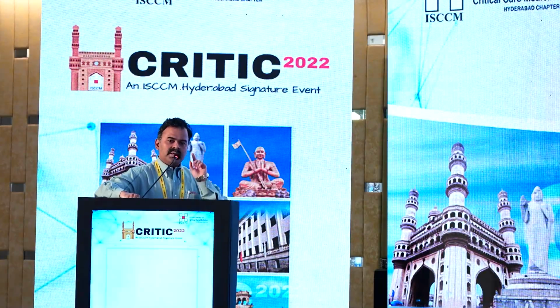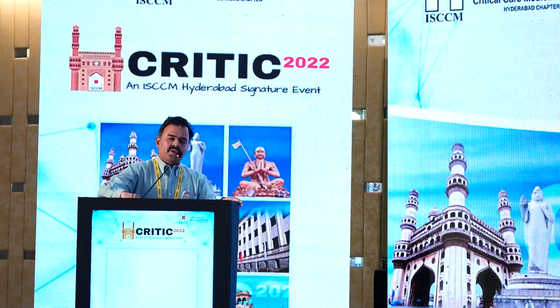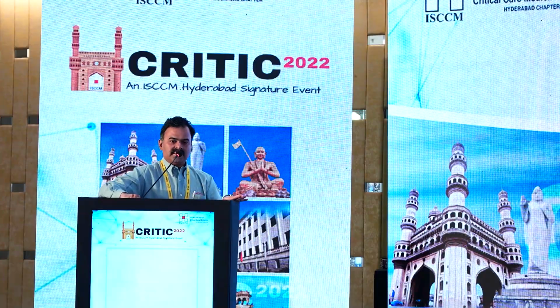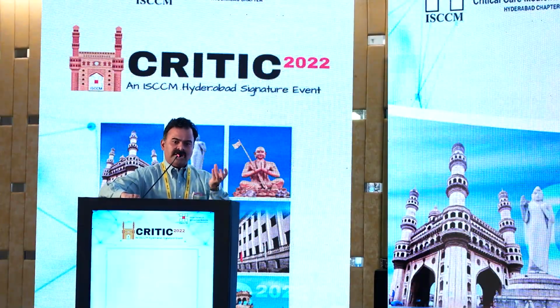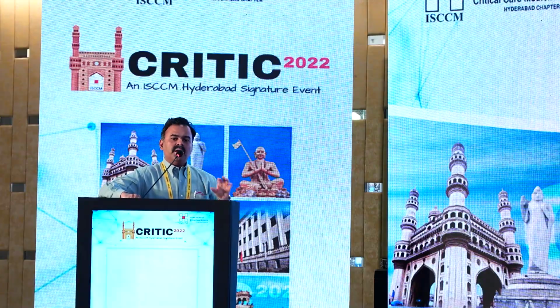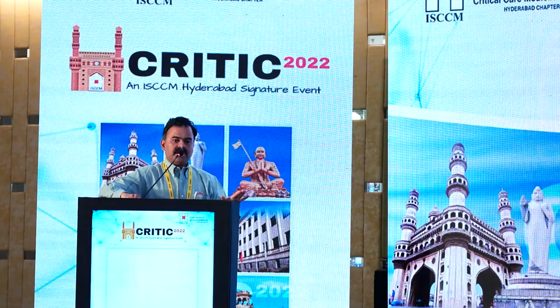So there is no single best answer. The answer will depend on the context. For example, if you are doing this in the context of, say, a drug toxicity or a first presentation of myocarditis, you put this patient on VA ECMO and then you find that the native heart is not contracting at all, it's distending. Then the solution would be an LV impeller. That would be the best in that context.